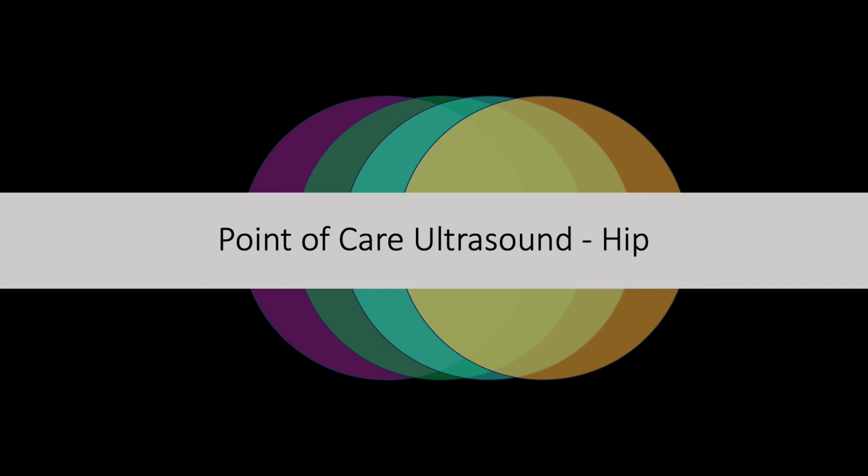In this lecture, our final one in the module on MSK Ultrasound, we're going to look at the lower extremity, starting off with the hip, then moving to the knee and the ankle. This is going to be pretty superficial, just scratching the surface of these different joints and the different things that we can see in them. But I'll try to give you a little bit of the flavor for what you might be able to see, focusing in on some of the larger clinical things that sometimes pop up in our clinic schedules.